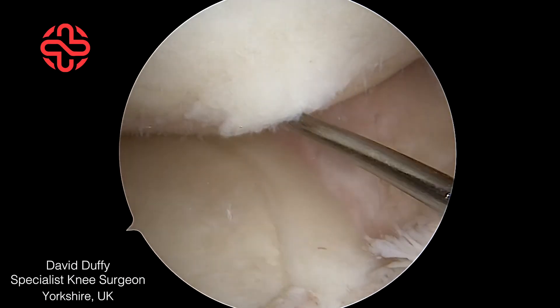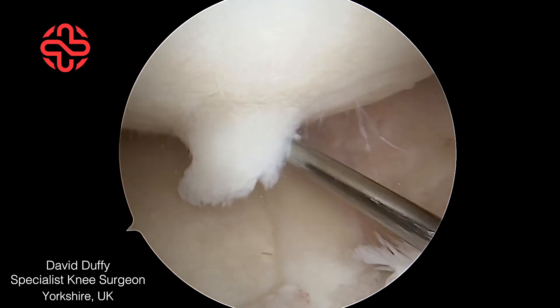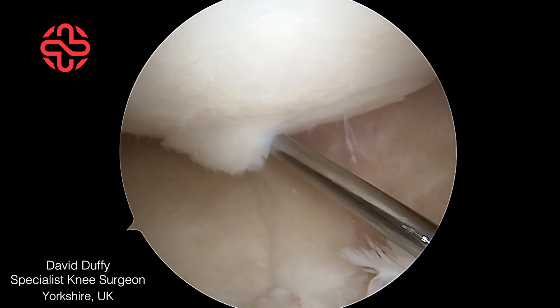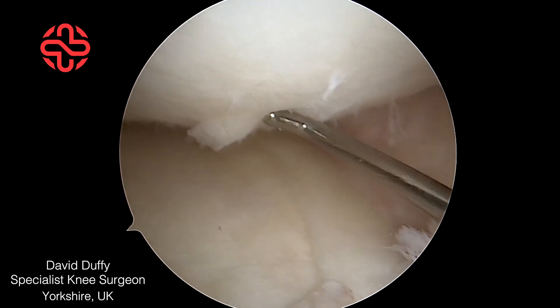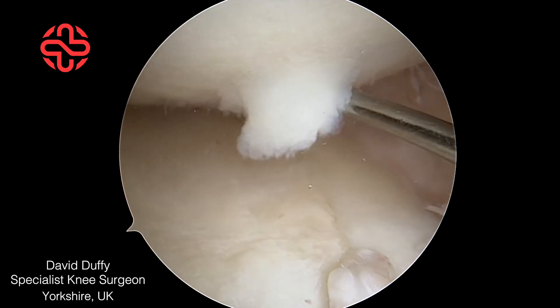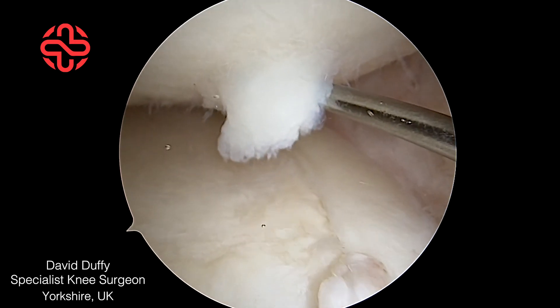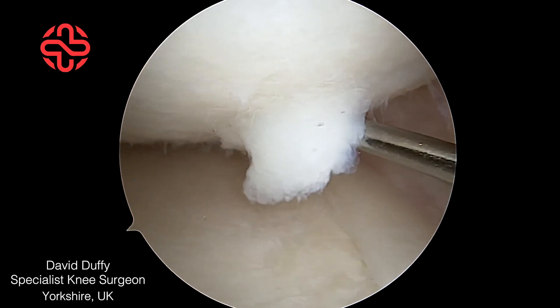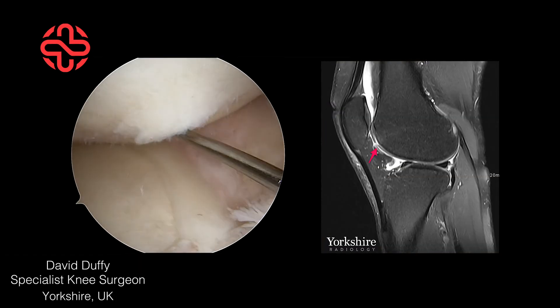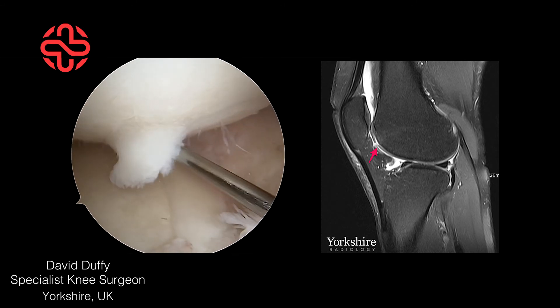Inside the knee, an unstable chondral flap is easily identified. The articular cartilage has separated from the underlying bone, resulting in an unstable chondral flap. This can cause pain and a catching sensation in the joint. It is not visible on a plain x-ray and requires an MRI scan to make the diagnosis.